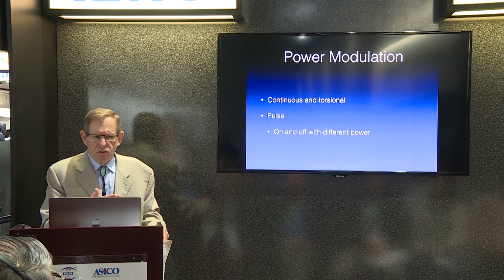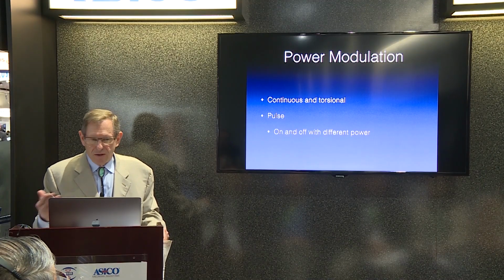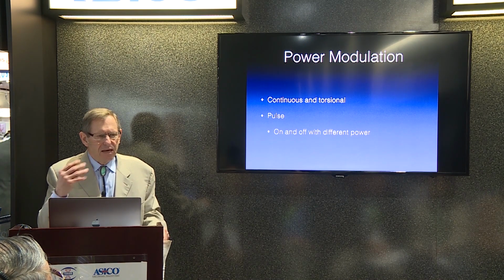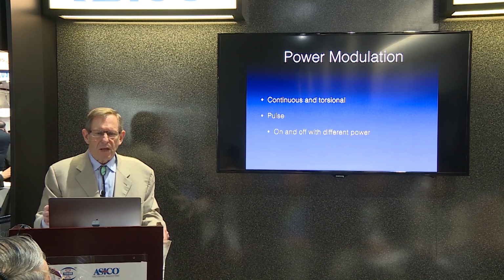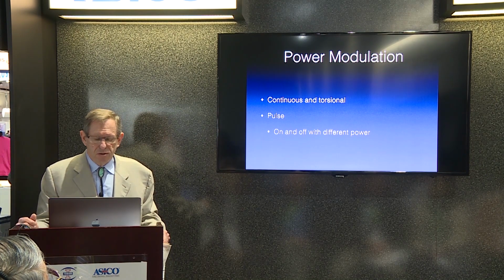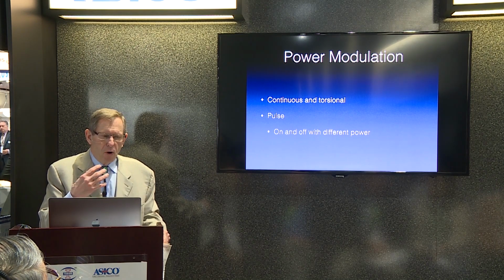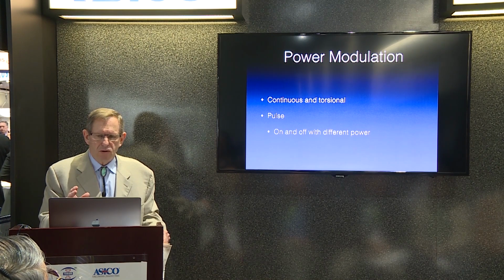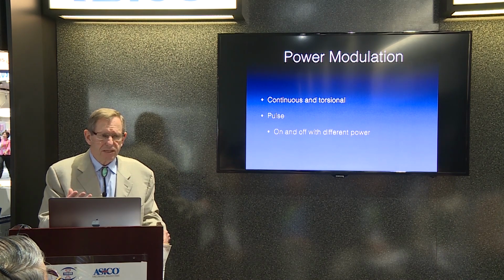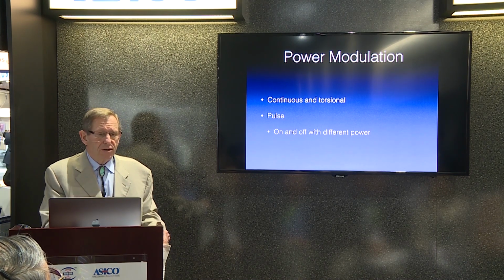I say, when you sculpt, what do you want the machine to do? Do you want no occlusion, slow hand, lots of power, whatever it is? Because they're not thinking of the physics of the machine. And the more we understand about the variables and what we can do, I think the better surgeons we're going to be. And pulse is interesting too. Most everybody trains in a continuous mode for most things, but pulse is really valuable because it decreases the energy, but it also increases the efficiency depending on the on and off time. And that varies with the hardness of the cataract.